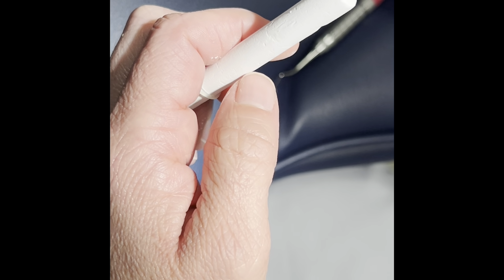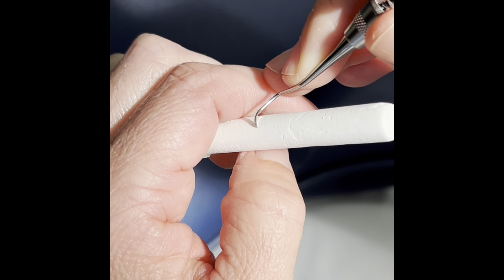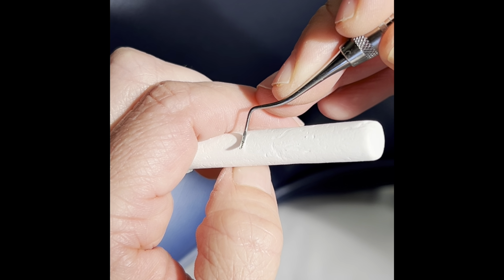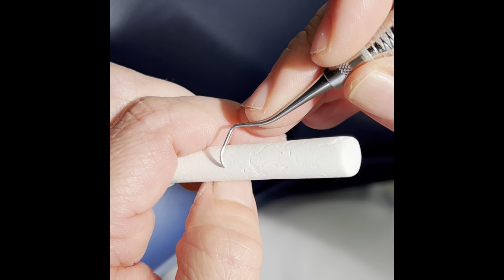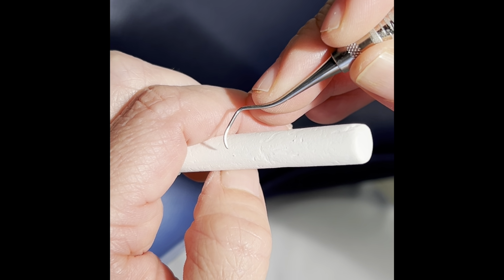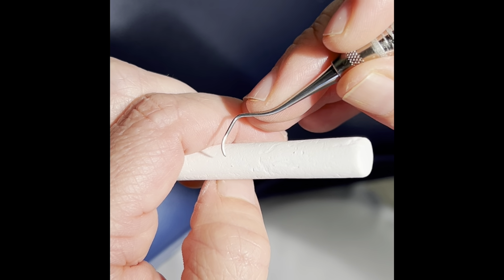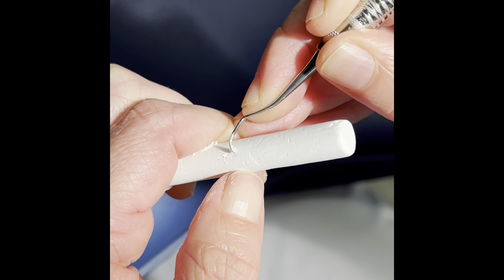Next is the calculus removal stroke with the Barnhart. And this one, same thing, we're going to look at the working end, and you can see that end is pointing away from the chalk. So we want to use the opposite. This end is correct. And with a calculus removal stroke, it's a short biting stroke. And with the chalk, you should have just short, deep chunk of chalk removed. So that would look something like this.